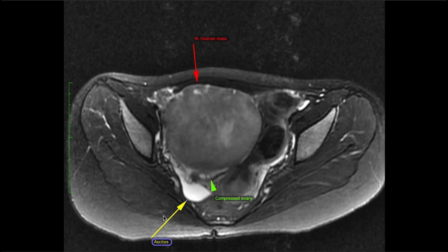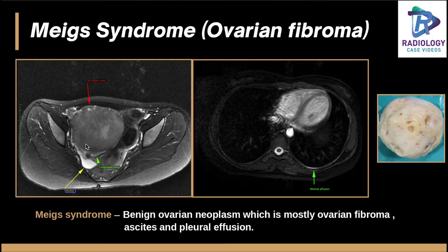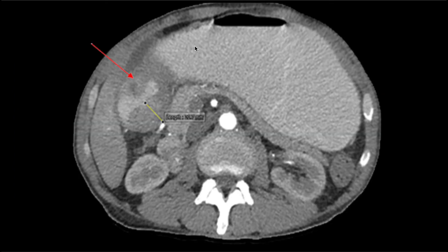This was a 23-year-old young female with a huge right ovarian mass. The compressed ovarian parenchyma is visible — the ovary was not torsed — and there was significant internal vascularity, ascites posterior to the lesion, and mild pleural effusion. This is a classical Meigs syndrome, where an ovarian fibroma is present. On histopathology, the ovarian fibroma is confirmed. In the scenario of a benign ovarian neoplasm, mostly ovarian fibroma, if ascites and pleural effusion are present, this is a classical Meigs syndrome.